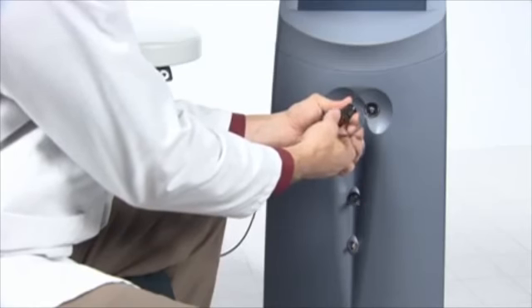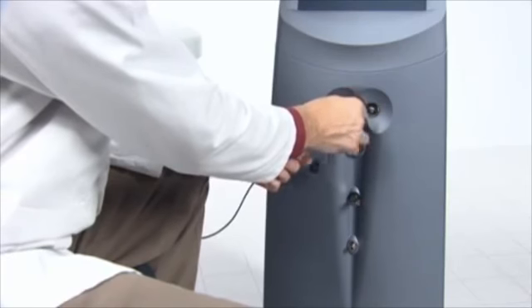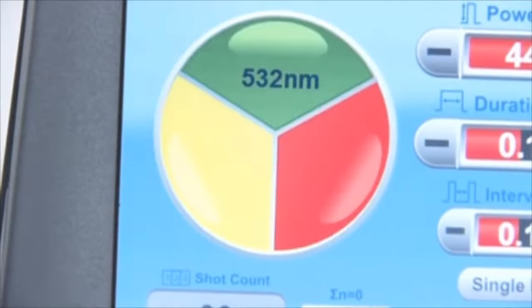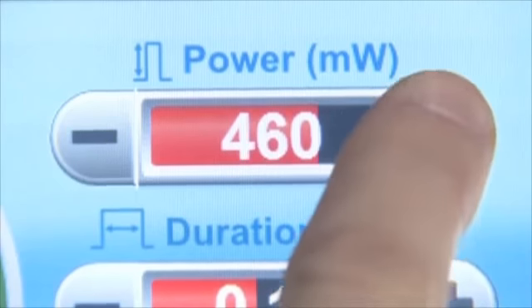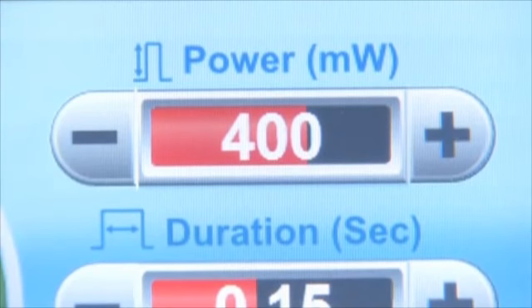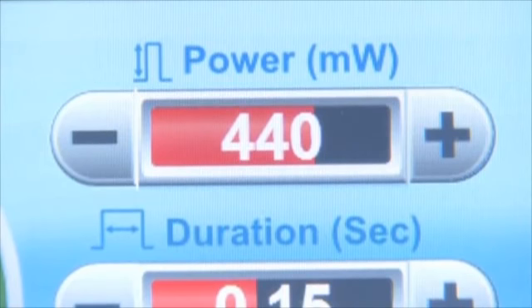If using a compatible laser indirect ophthalmoscope, you may also connect an LIO illumination power receptacle on the front of the laser console. The range of power settings varies for each laser color. See specifications in the maintenance chapter of the operator's manual for the available settings for your laser. If you attempt to select a power setting that is not available for the current color, the laser emits a low-toned beep to indicate that you have reached the minimum or maximum available power.